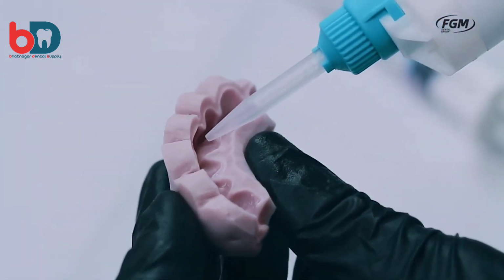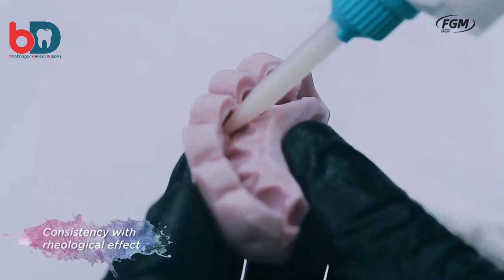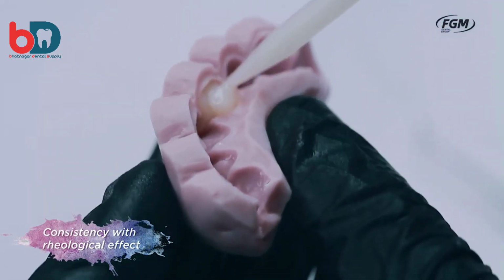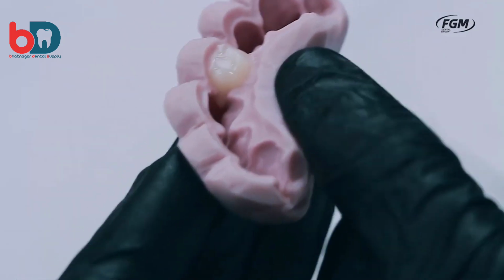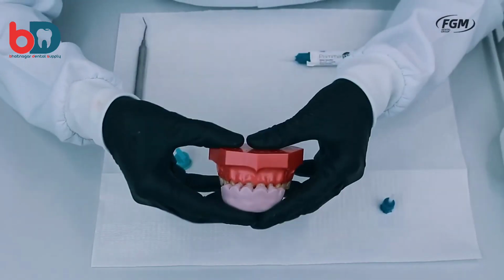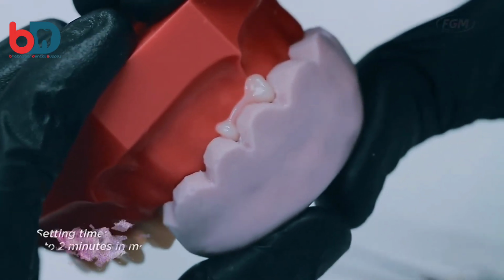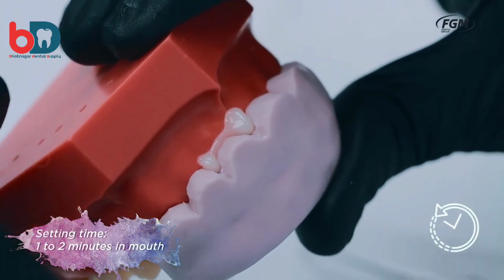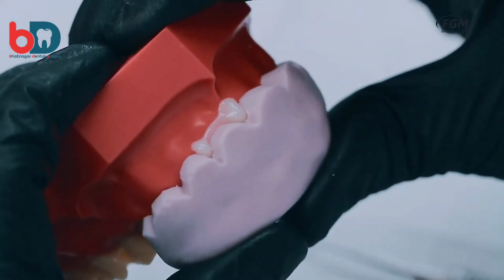We're going to apply the product inside the guide. It is possible to notice the consistency, the rheology of the product. It contains thixotropy, which facilitates application and prevents the product from running off, but at the same time allows for good replication of details. The application takes around 40 seconds and it has to be in the mouth for 1.5 to 2 minutes, which is the time of the plastic phase, for the removal of the guide and excess material.